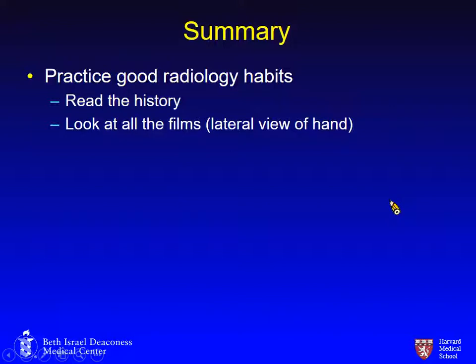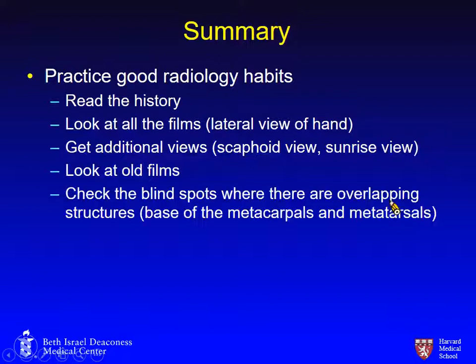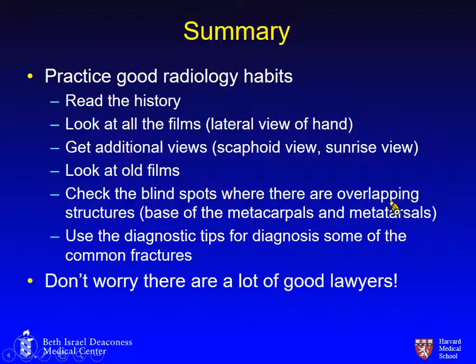Read the history. Look at the films. Look at all the films, including the lateral view on the hand. Get additional views if you need it. Look at the old films. Check for the blind spots where there's overlapping structures. And use some of the diagnostic tips that we talked about for how to not miss some of these common fractures. And don't worry, there's a lot of good lawyers out there.